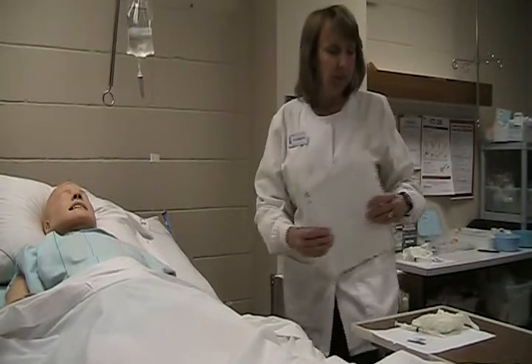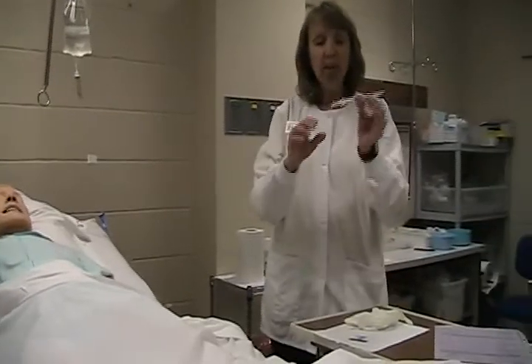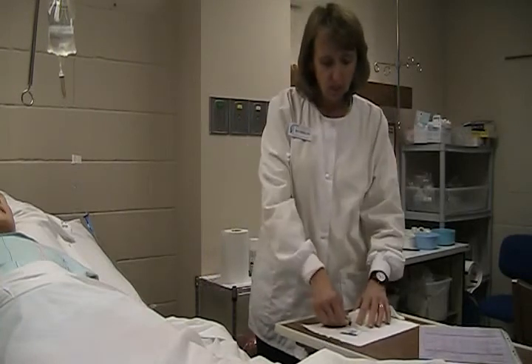You will then go to the med room and prepare your medication. Remember, when drawing your medication up in the syringe, be sure to label the syringe with the dosage of medication, the name of the medication, and your initials.